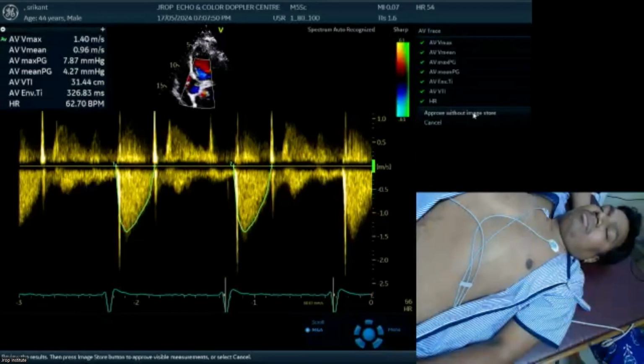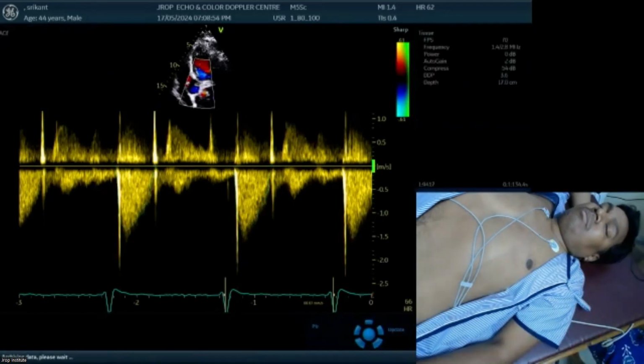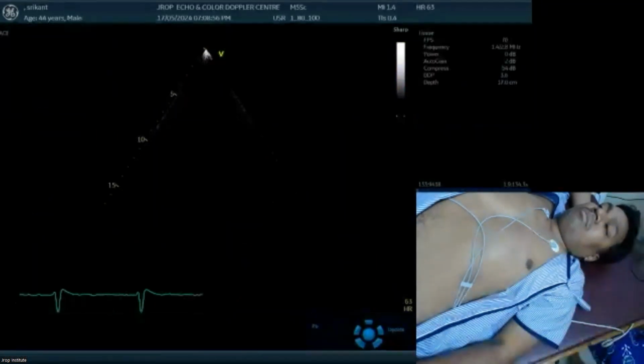Okay. Any other questions? So, Dr. Gupta, if we calculate the LVOT diameter and LVOT VTI, the machine will automatically calculate stroke volume. Look, the machine has so many functions. Unfortunately, we do not know about those functions and we don't switch them on. Look, my machine has everything activated. Now I'll show you how it's activated.